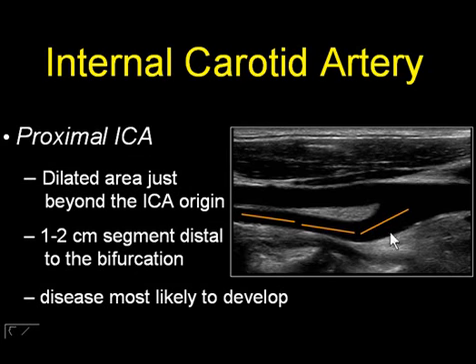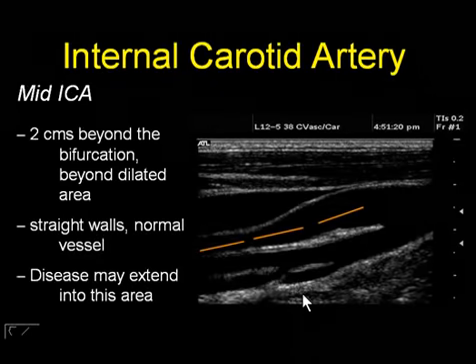All of the criteria that's out there and used for estimation of carotid stenosis has been validated for disease that involves the internal carotid artery at its origin. It's not applicable to the external carotid artery. It's not applicable to the common carotid artery or to the distal ICA. Although it is important to look at these vessels, the stenosis criteria really should be applied only to the origin of the internal carotid artery and sometimes the carotid bifurcation.